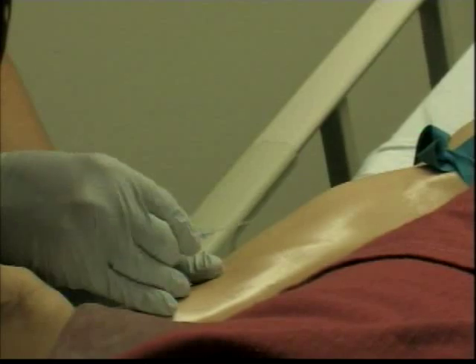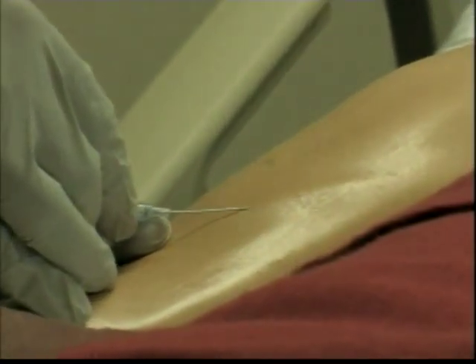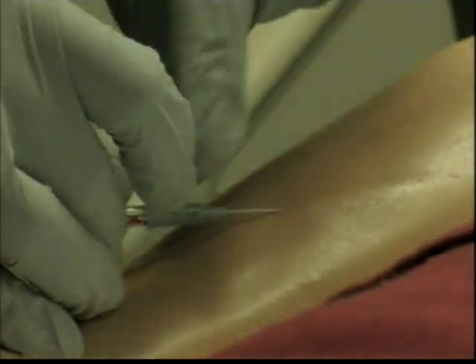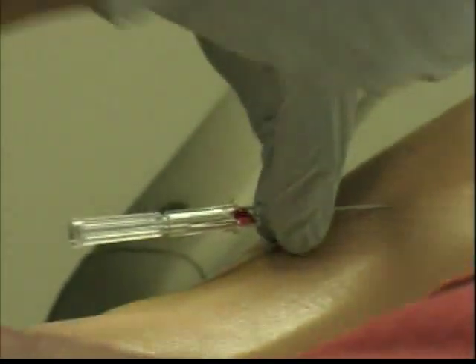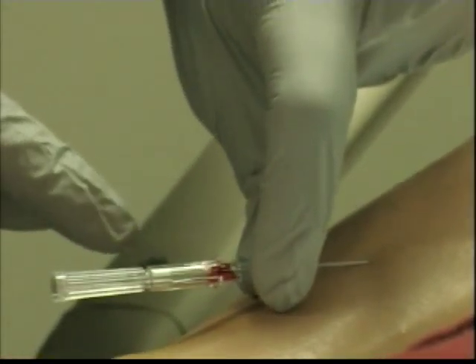You get your bevel up, needle at about a 10-degree angle, and you puncture. You actually tell the patient, I'm going to puncture, and you start seeing your flashback. Look what I do with my fingers. I'm holding the hub with my index and my thumb, and I'm lifting the other 3 fingers up. You see how the chamber is filling with blood?